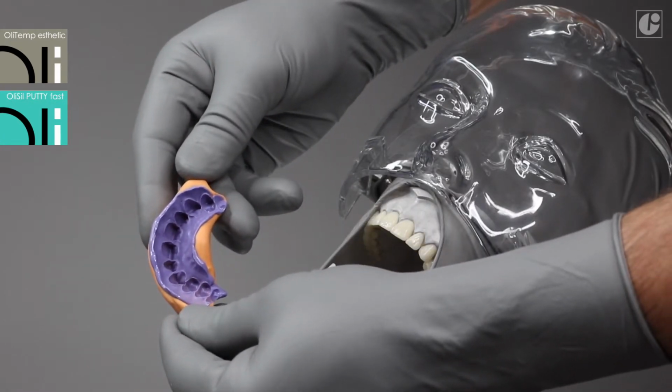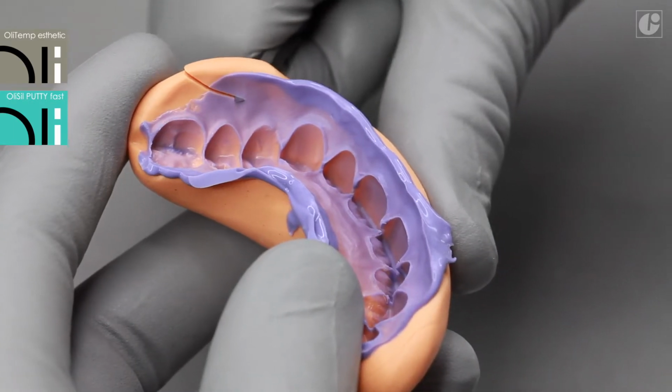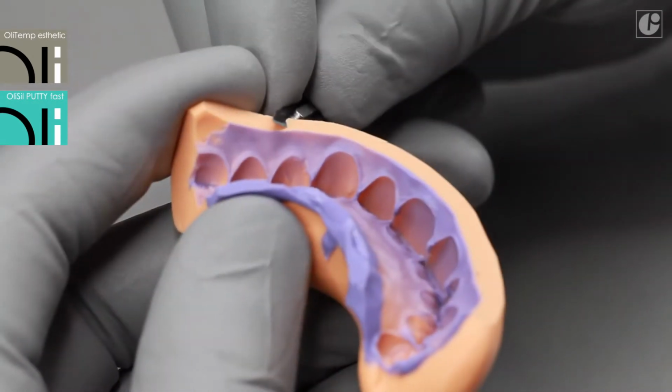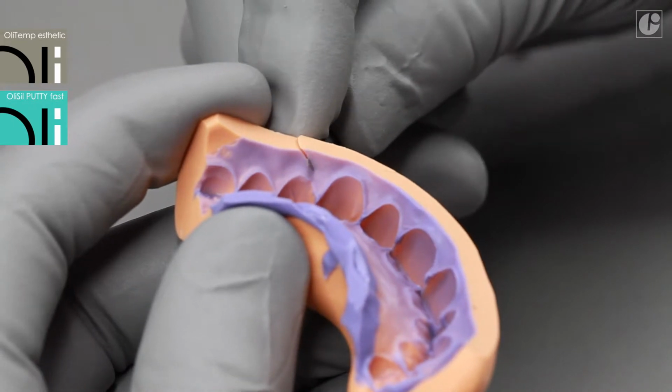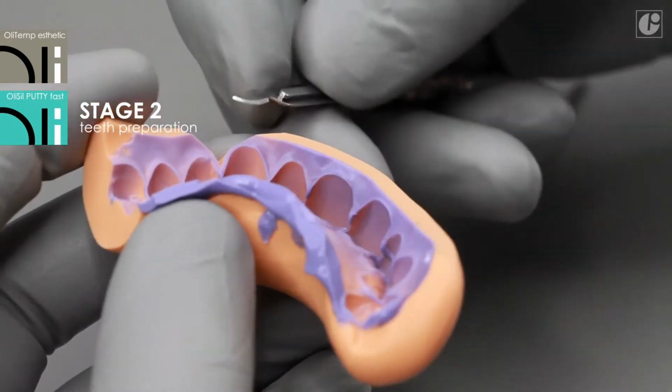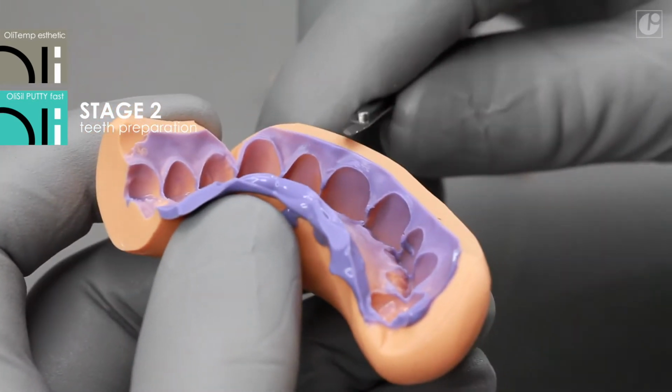The ready impression must be rinsed and dried, and the drainage grooves created for temporary material excess. It is also possible to cut interdental spaces to increase stability of the temporary restoration. After taking the impression, teeth can be prepared.